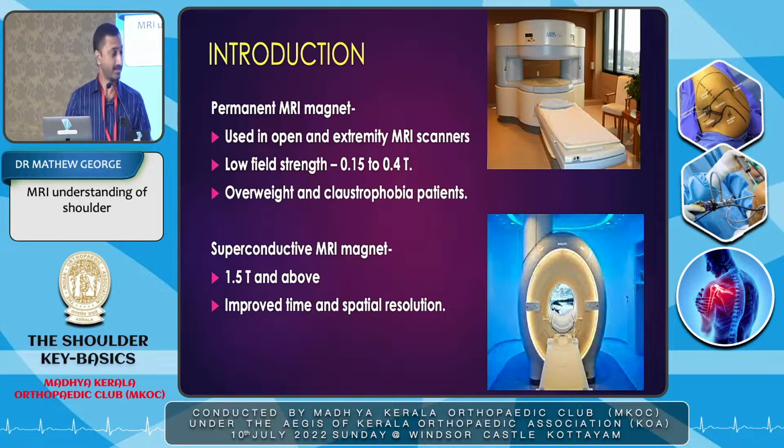you can see the bore there is very small. So it is into that part where the head and both the shoulders have to get in. If the patient is very bulky, overweight, it's very difficult. So that is one of the greatest disadvantages.